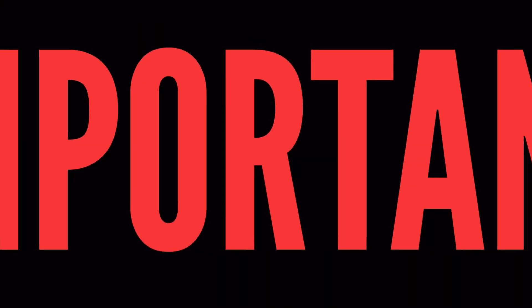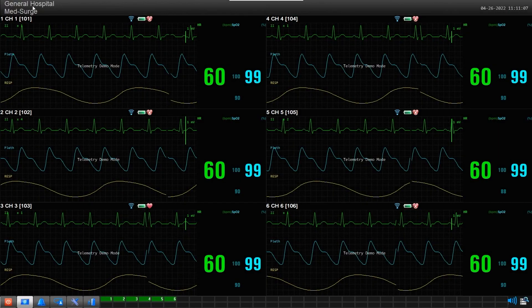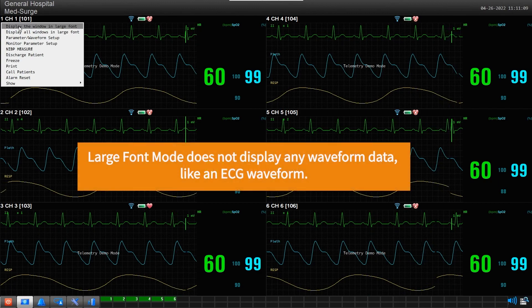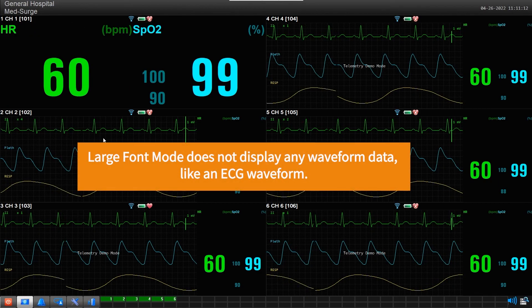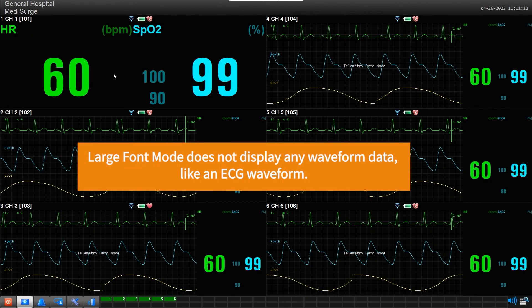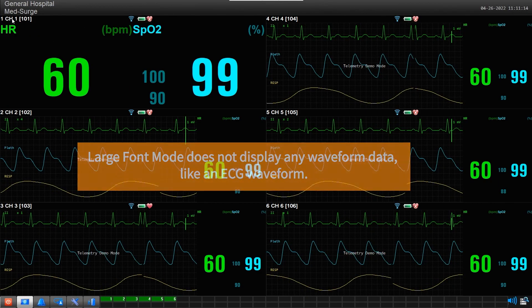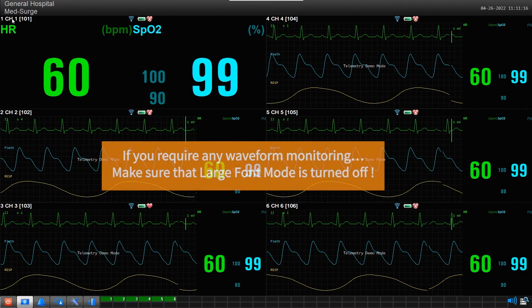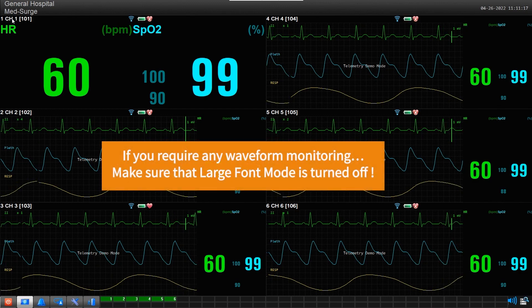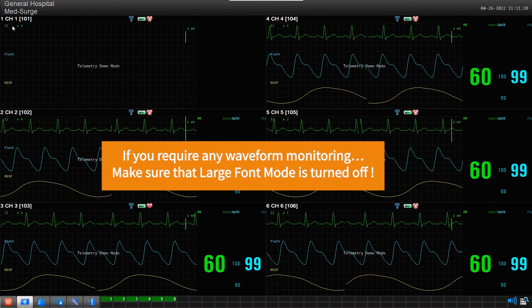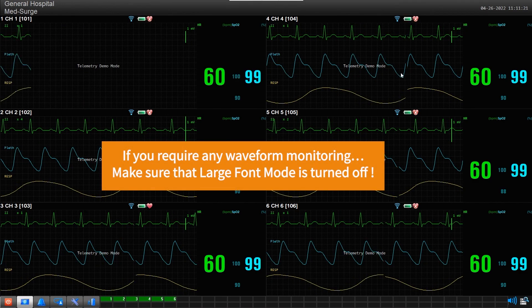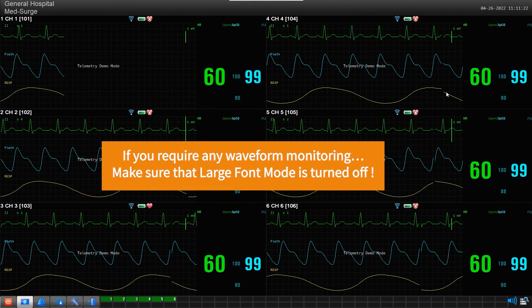Important: Large Font Mode does not display any waveform data, like an ECG waveform. If you require any waveform monitoring, make sure that Large Font Mode is turned off for that channel.